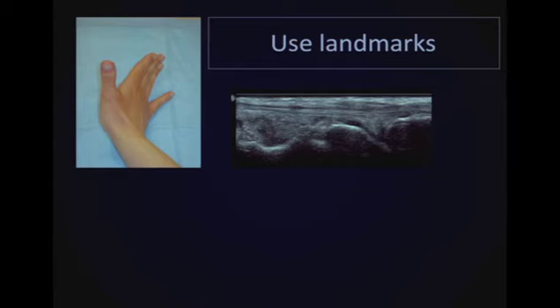But use this landmark. The EPL is actually the tendon that extends across toward the thumb and can be seen when you hyperextend or extend at the thumb. So I showed it to her on myself, and I said, look for this in this patient, and if you can't find it, compare it with the other side, which is very important. So here's an image of a normal extensor pollicis longus tendon, which was correlate of this tendon right here. You can see the fine fibrillar structure that is expected in a tendon.